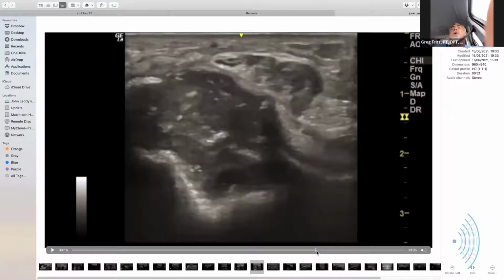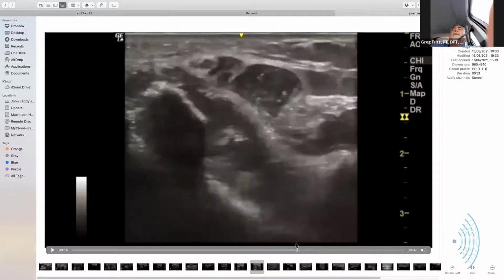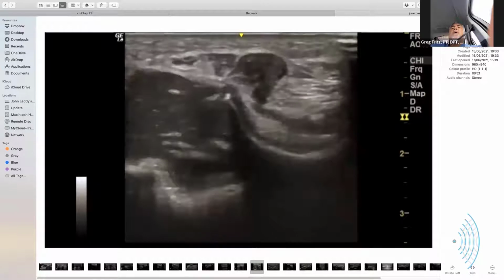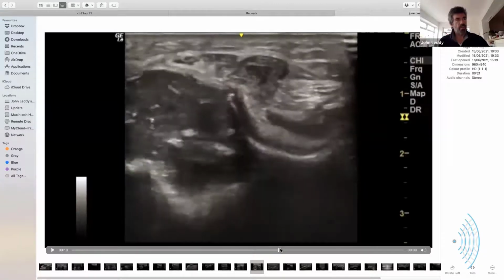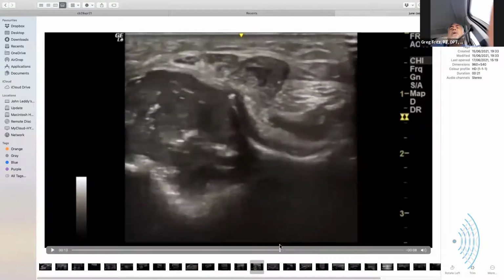Unbelievable. So watch as you're scanning the bone there. Yes. And you see how the bone is replaced by soft tissue. Wow. But you won't see that until you've considered that, because the guys in musculoskeletal see so few of these, they're almost blind to it. So you have to look. Wow. And know that you've got to see.